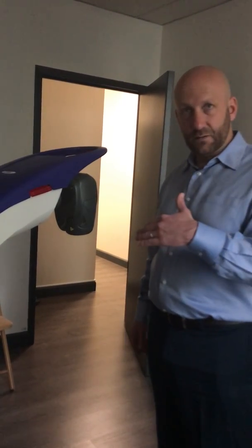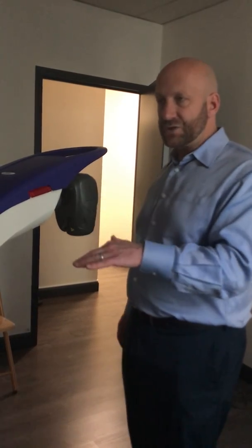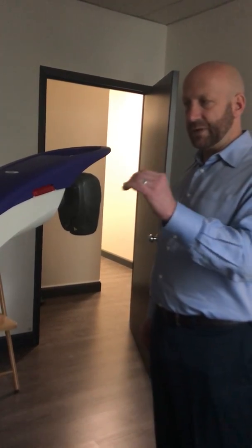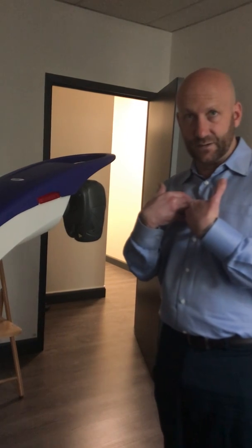I'm going to ask you, what's your pain level? Hopefully it's going down. How are you doing? Is the laser causing any improvement? If the laser is causing improvement, then guess what? That same 10-minute treatment, you're going to do the same thing. Why? Because that's the right amount of energy that's helping Mike Jenkins heal.